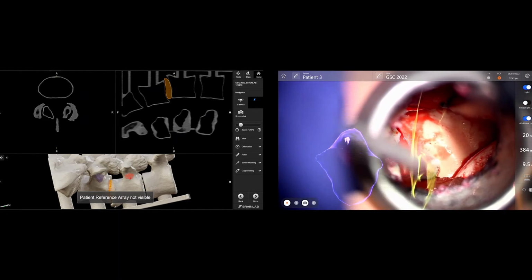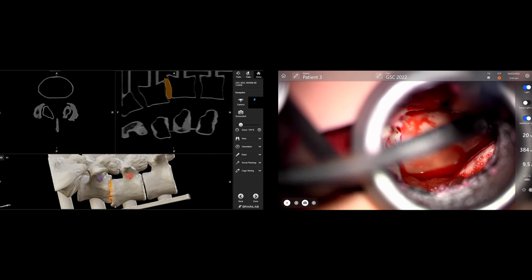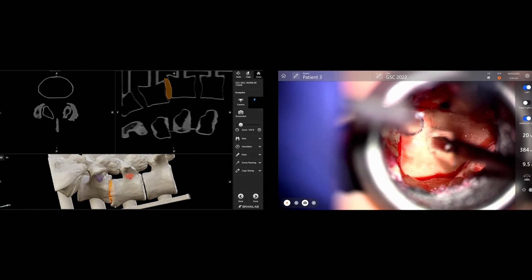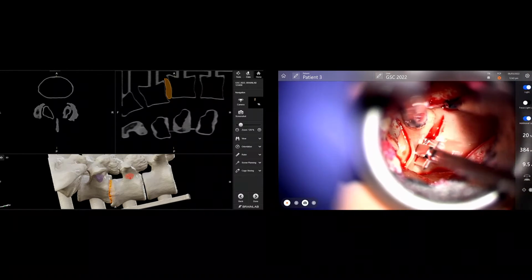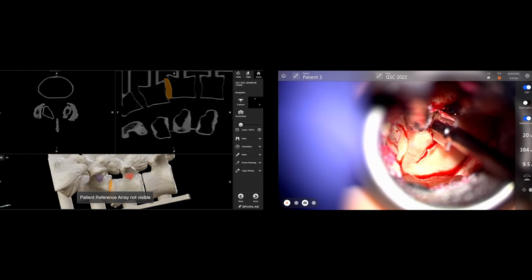So we're retracting the nerve root. We have a bayoneted knife. I use a 15-blade bayoneted knife. So now we cut into it, and after that we're going to use the shavers. I make an incision here into the disc space. So we got a nice, generous disc space. It's not always as easy to cut into the disc.